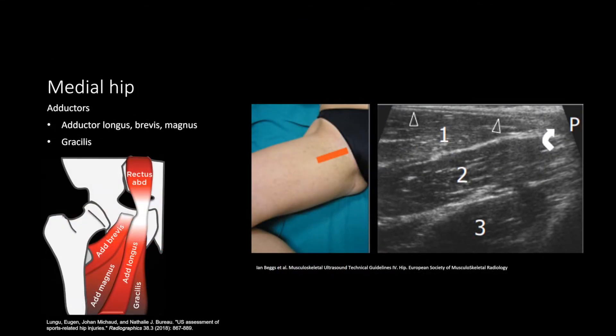For evaluation of the medial hip, have the patient lie supine in frog leg position. Look at the insertion of the iliopsoas tendon at the lesser trochanter, then move on to the muscle bellies of the adductor muscles. The three layers from superficial to deep are the adductor longus, adductor brevis, and adductor magnus. Note that the gracilis muscle is in the same superficial layer as the adductor longus, but is more medial. Follow the muscle bellies to the pubis to evaluate the tendinous insertions.